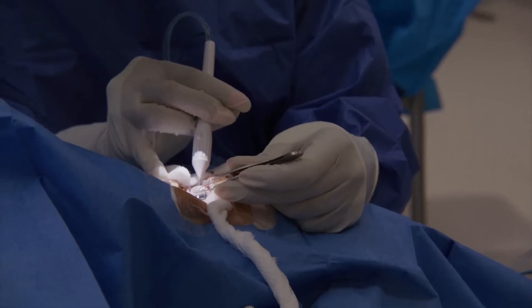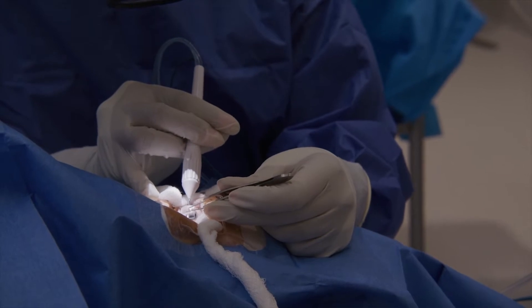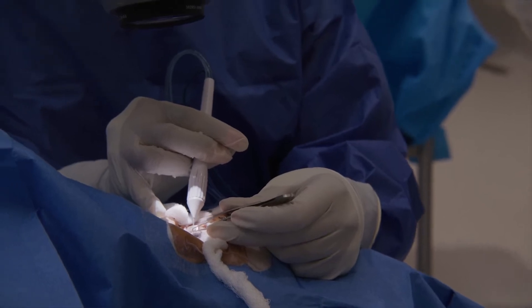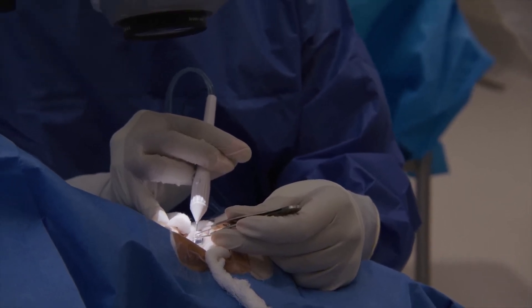Let's look at a mixed goniotomy technique with the trabectome, where you can be striving for up to 180 degrees of treatment in the nasal angle. I found that after going in with the dominant hand in the dominant direction, the view and positioning are fine. But when going in the opposite direction — where my hand feels more awkward, turned and kind of going in the non-dominant direction — I tend to have less of a clear view. That is in part because of the created tension on the cornea with my prism trying to move the lens to see more of the angle, in addition to the tension being created by my grip.